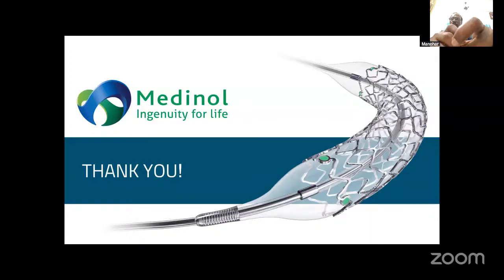How it is doing these things? After my presentation, you will understand what are the advantages of this stent compared to other stents. We'll wait and see. But imaging, I have not done for this patient. In future, I want to do the imaging for these patients. In my presentation, you will see it.